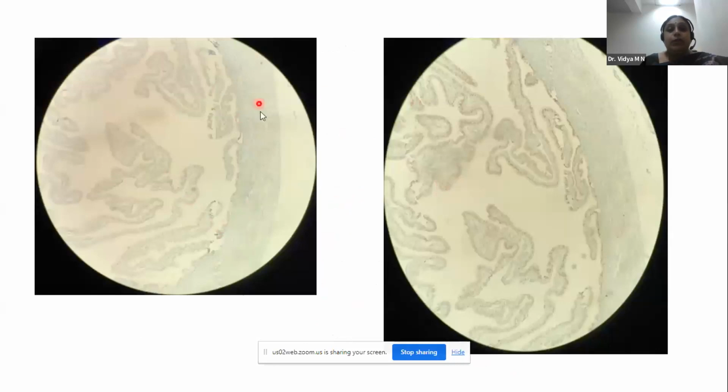Look at this. This is an image that I wanted to show. Recently, we had a nuclear antibody which just did not work. So you can see that this is the fallopian tube lining. This is a nuclear antibody. So this was for WT1 actually. And you can see that very occasional cells were staining in our first protocol. Now we come to our second protocol. We can see a lot more brown staining happening, but still not so satisfactory.